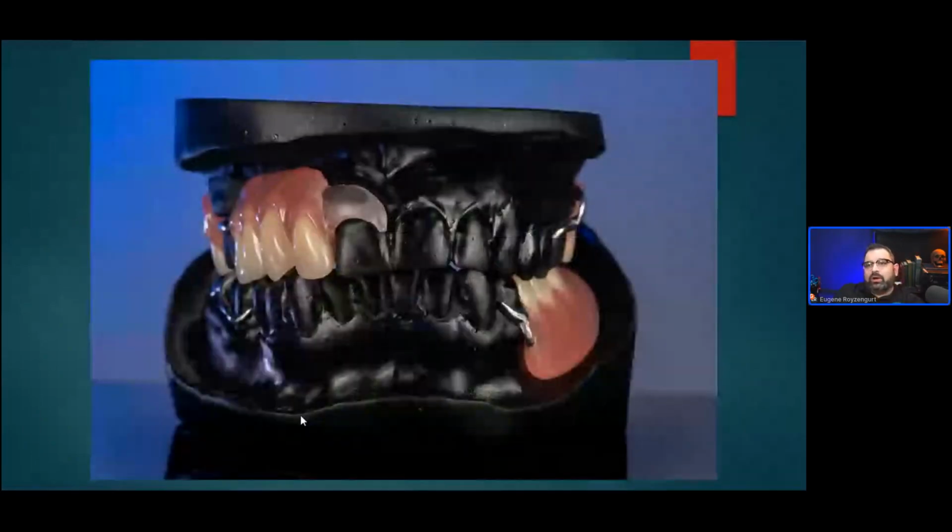Okay, so what do I usually do in my practice when it comes to 3D printing? The first thing I started doing is duplicate dentures. Duplicate models, I'm sorry, because over time, especially with partials, it works a lot easier for me to take a model, scan it in with my scanner, and print a replica of that, print a duplicate, so I can process on my stone cast, and then I can fit it to the printed cast. So duplicate models work really well.